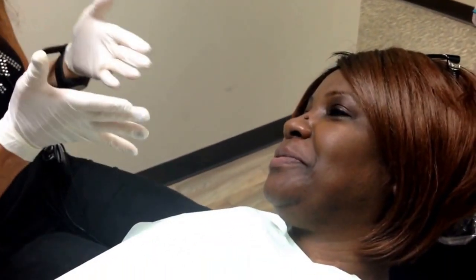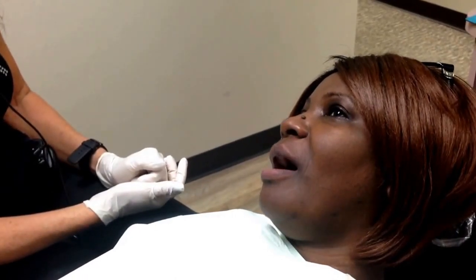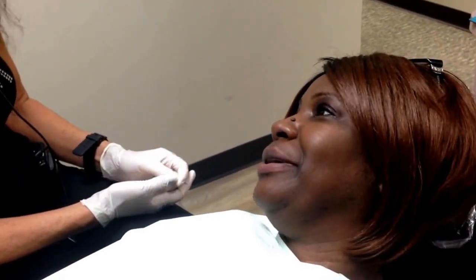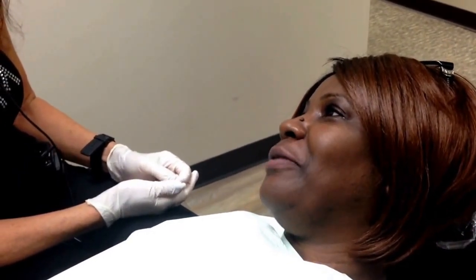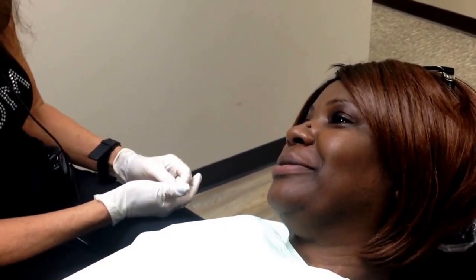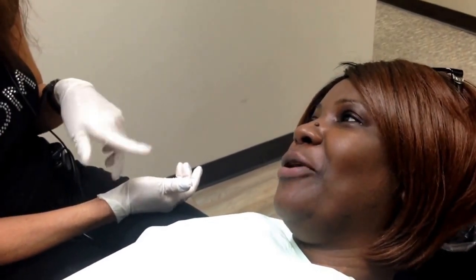How are you? I'm great. Tell us why you chose to have a snap-on smile for just your lower teeth. I had my uppers worked on a few years ago and it left my bottom ones looking horrible. And after seeing you on television numerous times, I finally got up the nerve to come and check you out. And I'm glad I did. I think you're going to be really excited today because I took a preview — the patient has not seen them yet. This will be the first time she sees them.